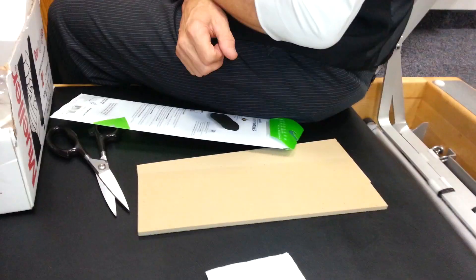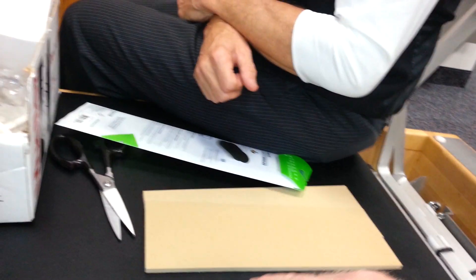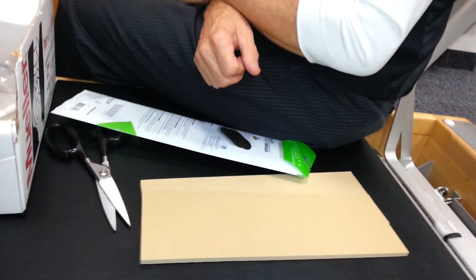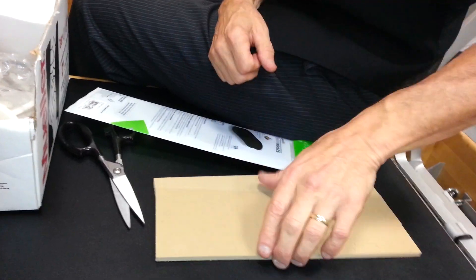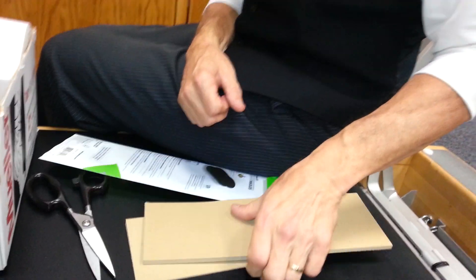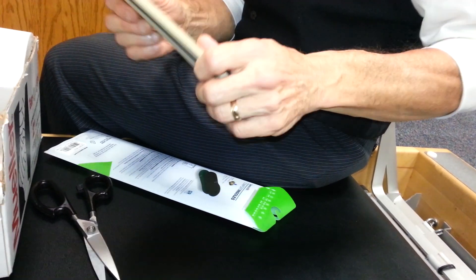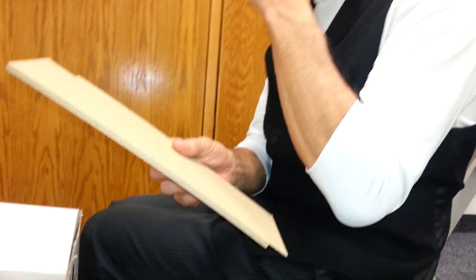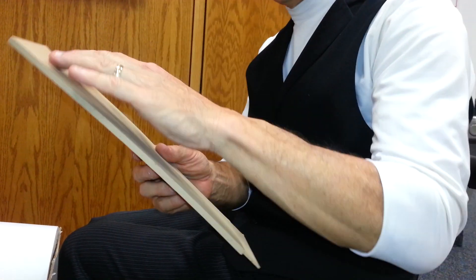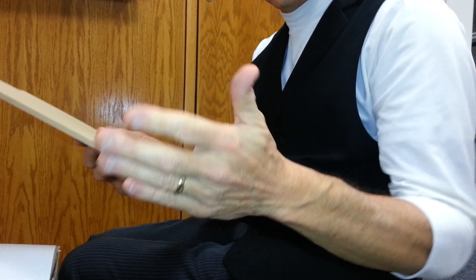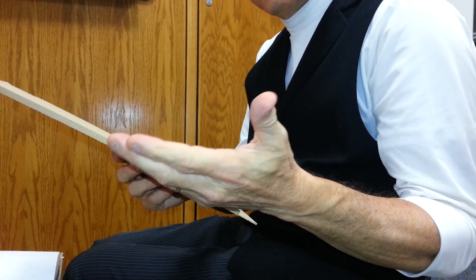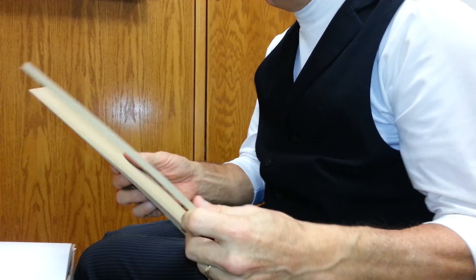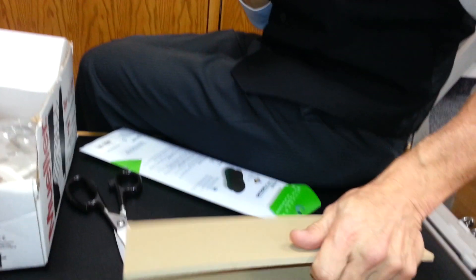So really you're just, on the cork idea, you're just cutting out a new insole. It's just an angled insole. Yeah, it's an angled insole. But what will happen is this cork will form to her foot because it will indent because it's cork. It's not steel or plastic and it works really quite well. And these will last for a whole mission.